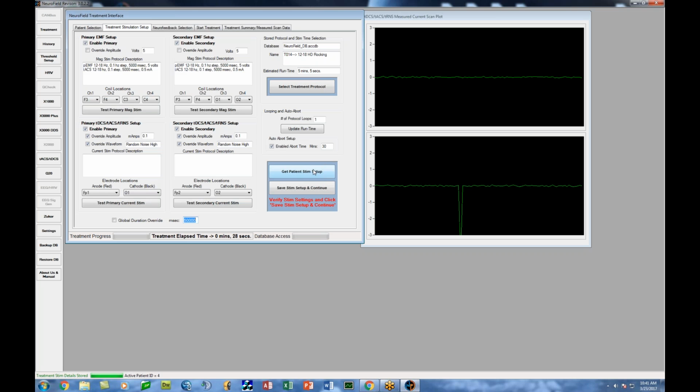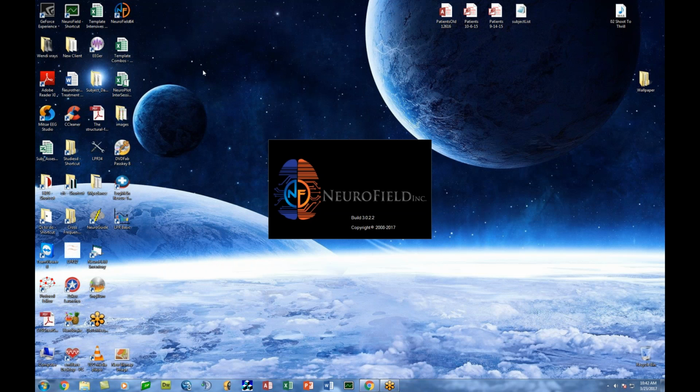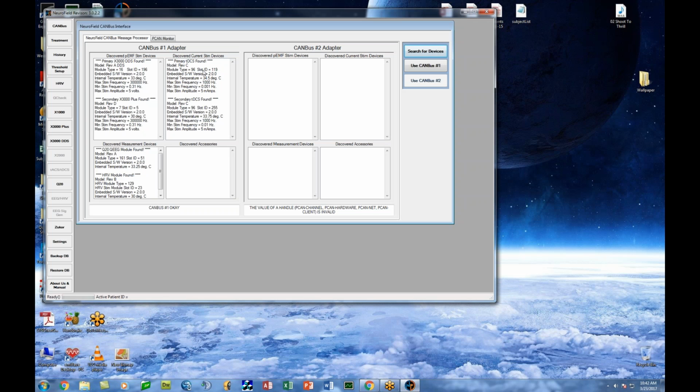Now from here, let's say I have a person that we want to do either some slow wave, or we want to get somebody that we want to slow down. So I'm going to set up a new patient here. Person comes in. We don't have a quick check, a Q check hooked up, do we? Okay.